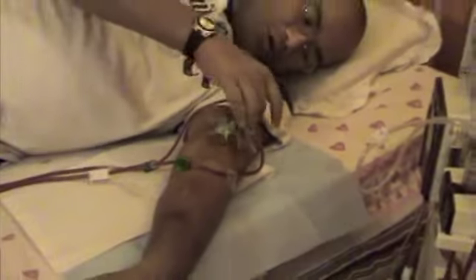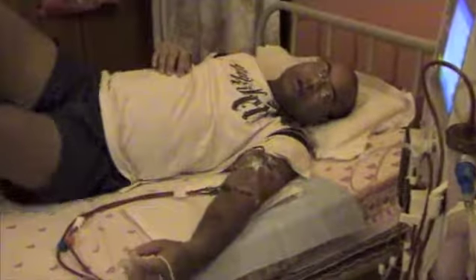So I can only move it a little — that's it. I got pretty used to it because if I'm allowed to move my hand too much, the needles get dislocated and then blood starts flowing out.